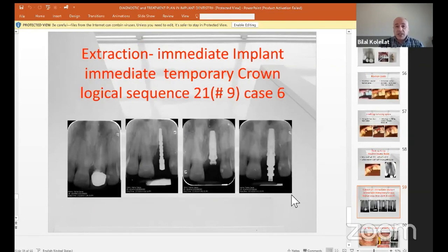Now, an extraction, and also when it is well planned, this is done in my private practice, when you have your colleague working together, better than being referred from one place to another. So extraction, immediate implant, and immediate temporary has been performed. Unrestorable tooth, you can see this left central with poor root canal, recurrent caries under the crown, extraction, the pin guide to see the paralleling and the proximity with the nasal floor, immediate implant, impression done directly.